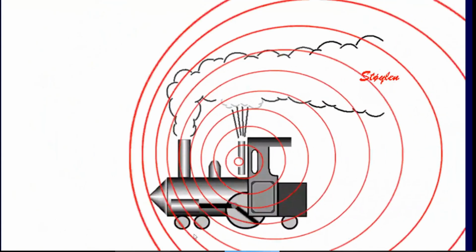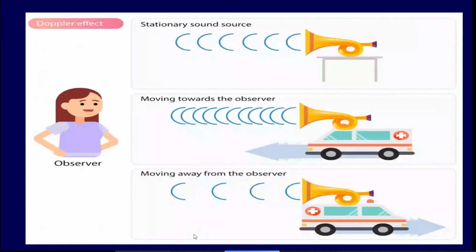By knowing the Doppler shift, we can know the direction and magnitude of blood flow, or for that matter, the magnitude and direction of the object which is moving away from the transducer. This is evident when you stand on the railway station platform.